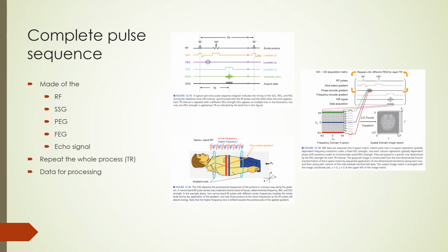The whole process of phase encode gradient row, 256 frequency encode gradient columns, echo detection, repeating for several signals and averaging is repeated based on the repetition time TR until 256 frequency encode gradient columns have been applied to all 256 phase encode gradient data rows selected.